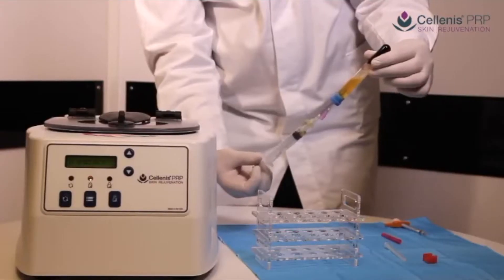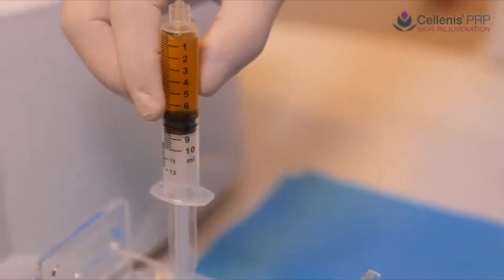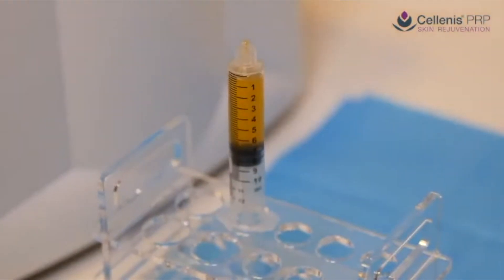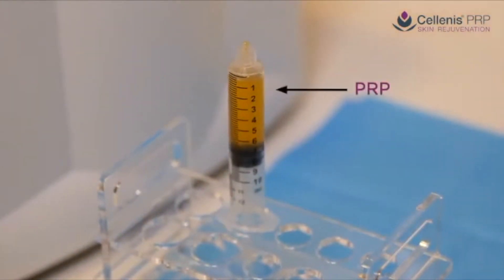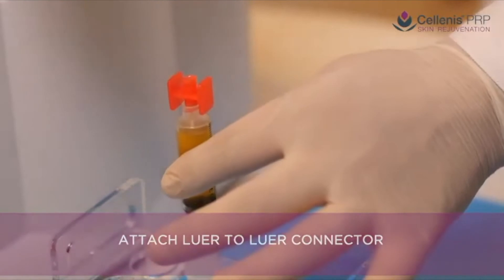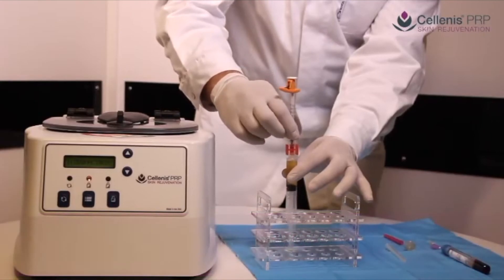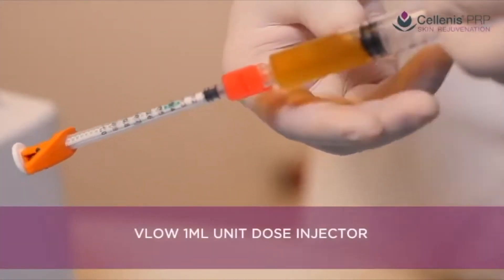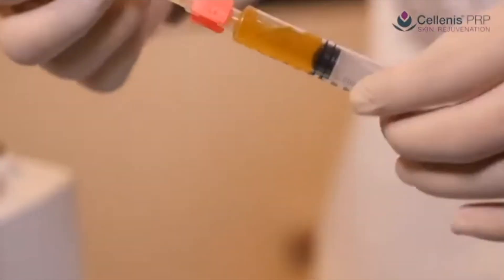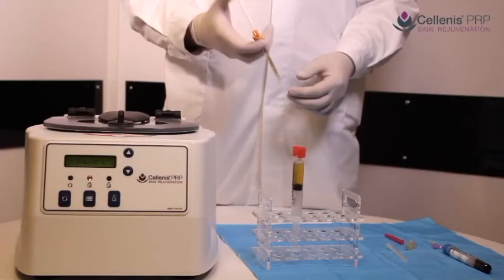An 11ml blood draw produces between 6 and 7ml of PRP. To withdraw PRP into a smaller volume syringe of your choice, a luer-to-luer adapter can be used. The VLO unit dose syringe is shown as an alternative to standard injecting syringes. This syringe significantly speeds up the injecting process — a set volume of PRP is injected with each click of the plunger, reducing injecting time by half.